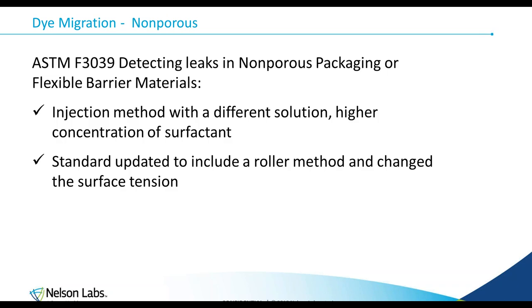There's ASTM F3039, but this is for non-porous packaging. The previous test was for porous packaging. And then this is also similar. We inject the dye solution into a foil or a poly-poly pouch and then look for leaks.